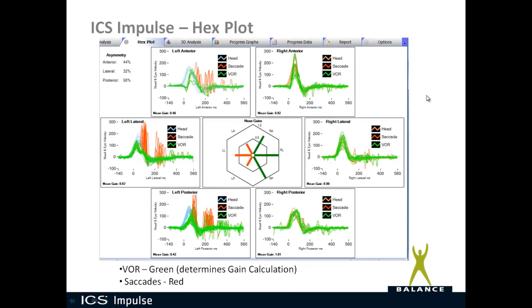The new hex plot, introduced in software version 2.0, provides an easy visual view of all six canals: left anterior, left lateral, left posterior, right anterior, right lateral, right posterior. Green bars are within normal limits, orange bars are abnormal (low gain), and yellow bars indicate gain above 1.2. Bar color is based on mean gain — for example, left lateral mean gain 0.67 falls in the gray region so the bar is orange, while right lateral mean gain 0.99 falls in the white region so the bar is green.